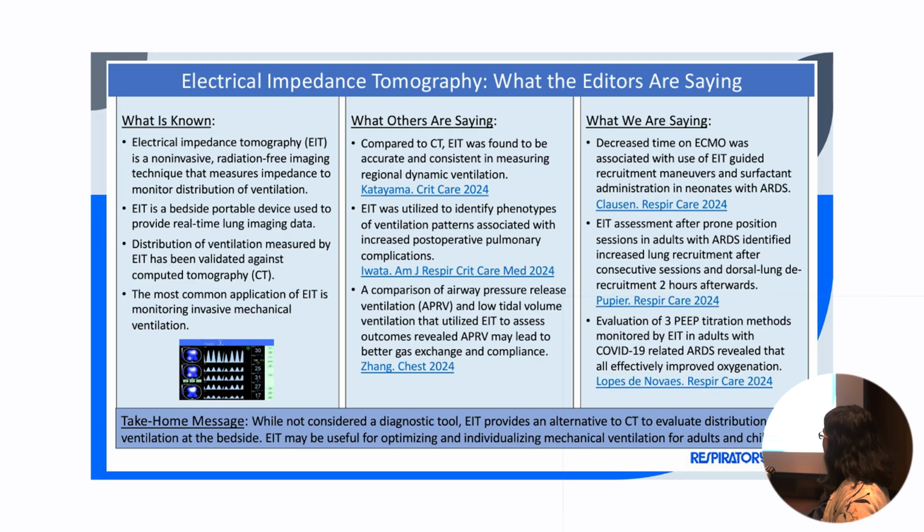I'm just gonna zoom down to the take-home message: you can think of electrical impedance tomography as an alternative to a CT to evaluate distribution of ventilation at the bedside. As someone earlier mentioned, taking ECMO patients to CT is really difficult.